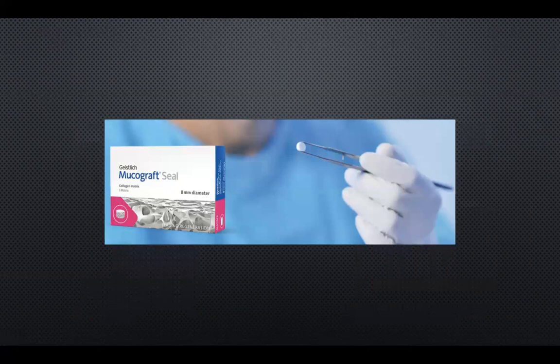There is an alternative solution, which I talked about. It's called the Mucograft Seal. I think this is developed by Geistlich, and I think it's from a bovine source, and it's a collagen matrix.